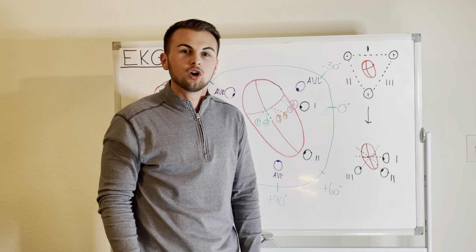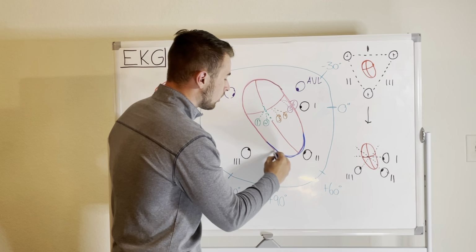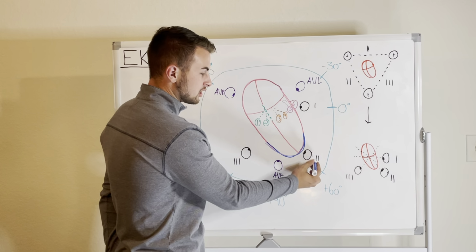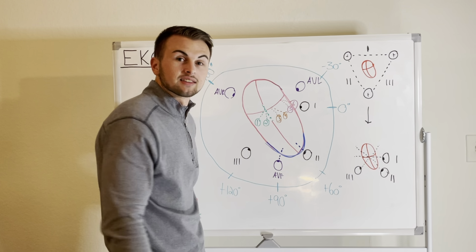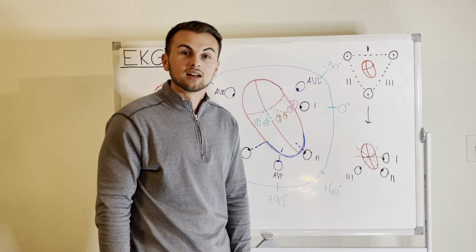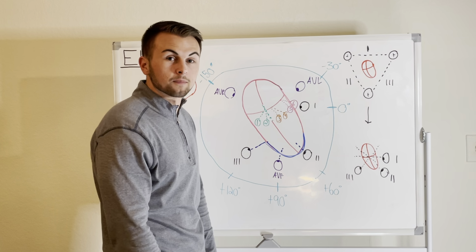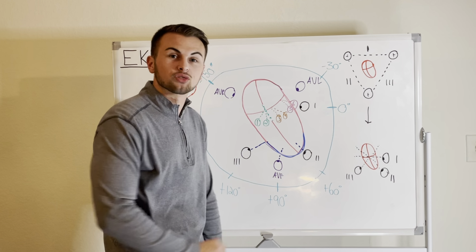If you have a patient who has had an infarction of the inferior left ventricle, which cameras would be able to take a picture of this infarct? The cameras in lead 2 are looking at this. The cameras in lead aVF are looking at this. And the cameras in lead 3 are also looking at this. Now we are beginning to learn how useful the EKG can be. So if our patient has had a heart attack or an injury to the heart in the inferior portion, we will be able to see it in leads 2, aVF, and 3.